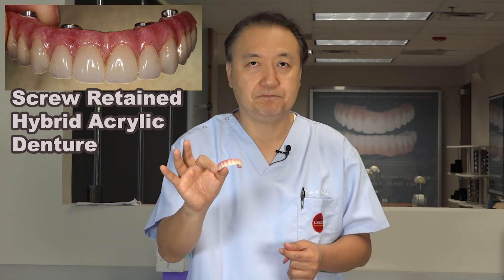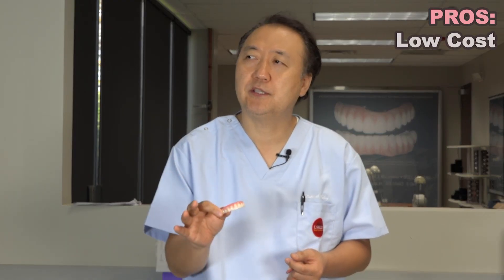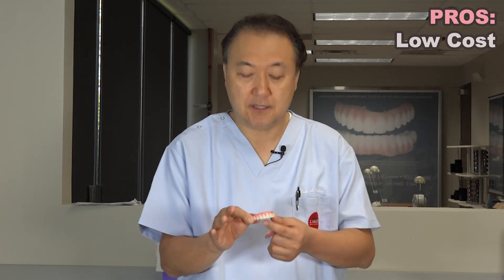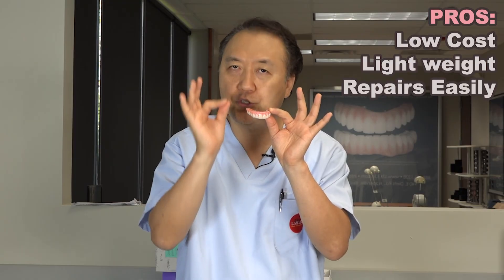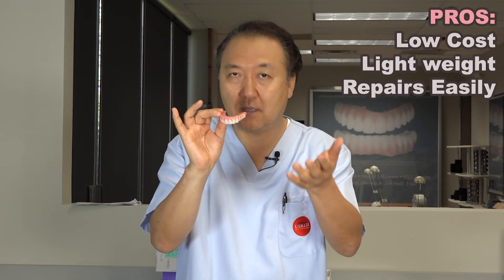If you choose a screw-retained implant denture, here are the pros: lab cost is much less — probably $1,500 up to $5,000. Doctors choose this because it's light, easy to repair chairside. This is acrylic — I call it plastic — and cleansability is really good.